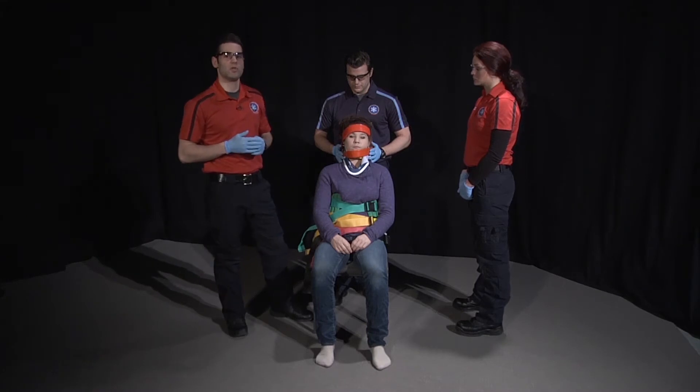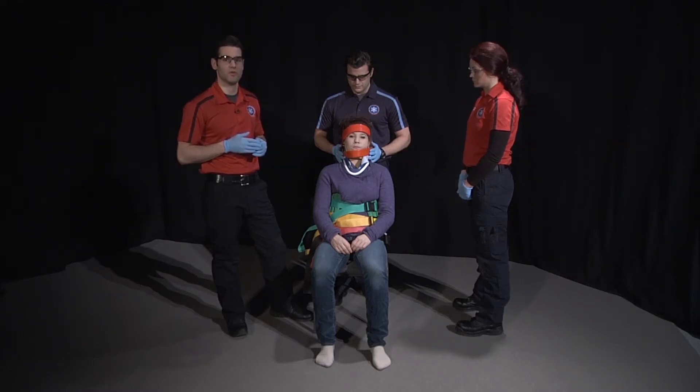We'll then move the patient to a long spine board, release the leg straps and secure the patient to the long spine board, and reassess motor, sensory, and circulatory functions in all four extremities.